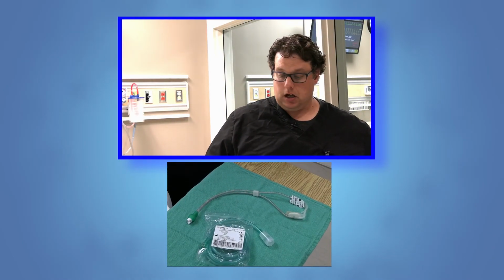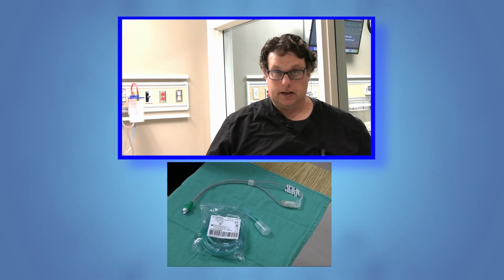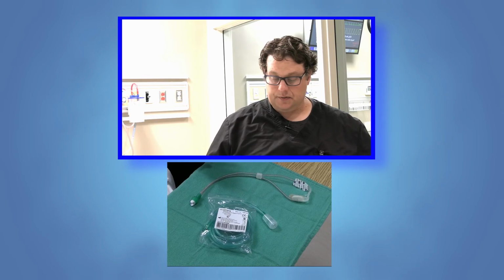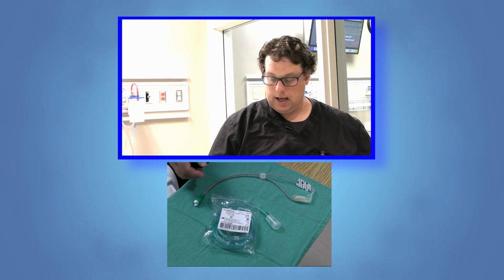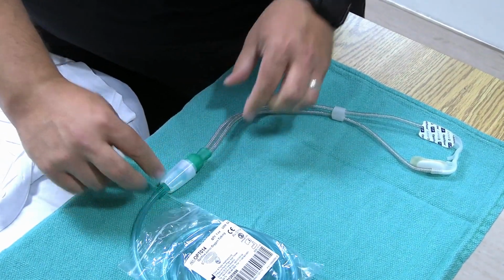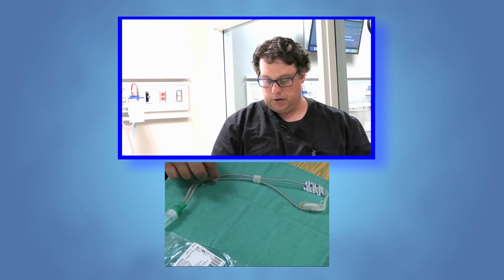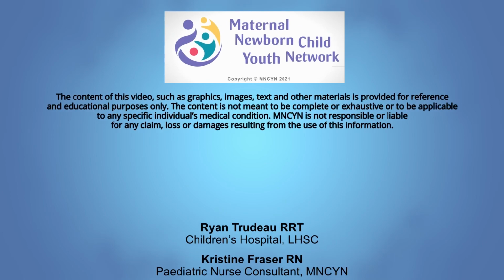The last thing I wanted to show you guys regarding the high flow oxygen therapy is the fact that if you had to transport your patient to X-ray, to CT, or even up to the patient ward, you can't use the AIRVO device because it doesn't have a battery backup that will allow you to transport your patient on it. But the company has developed its own special oxygen tubing that you can use in order to keep the nasal prongs on your patient. And then basically it's this special connector that you'll see here that then will just attach to your nasal prongs. And then that way for patient comfort, you don't have to fiddle with switching between nasal prongs for patient transport. The only time that you might need to switch off of these nasal prongs is if your patient is going to MRI, because the coils in here that help keep the heat and moisture in the nasal prongs are obviously metal, and metal can't go into the MRI.